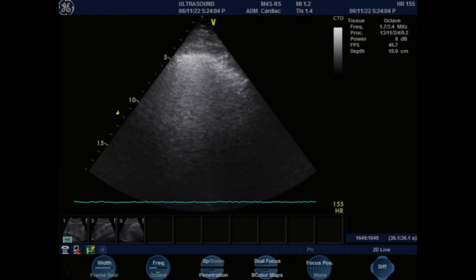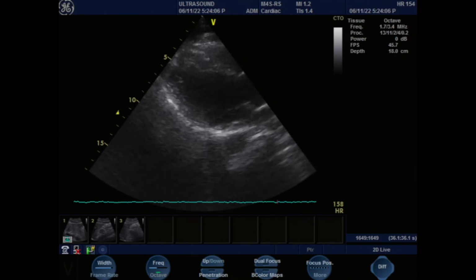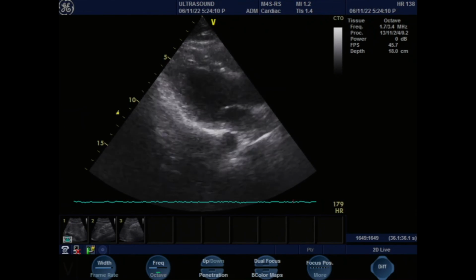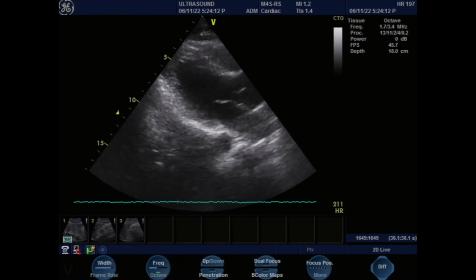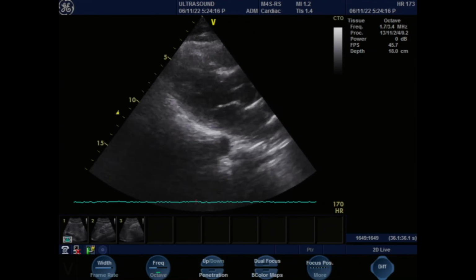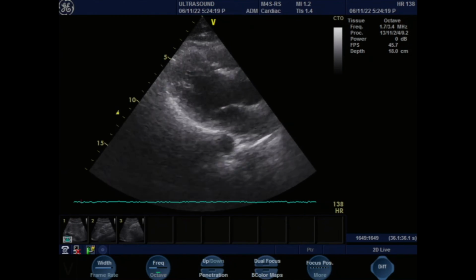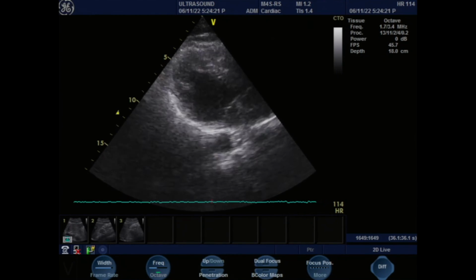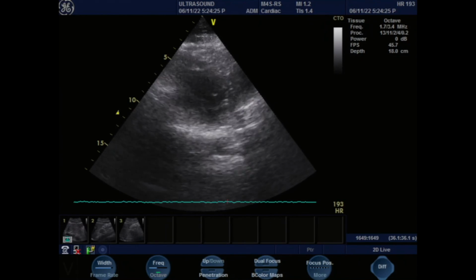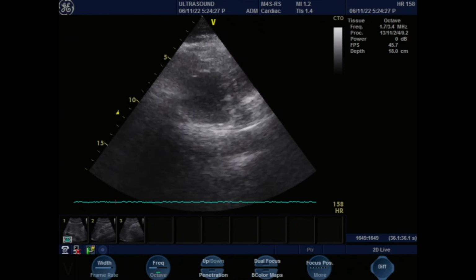Look at the landing. Perfect. There you are. Now you see the entire left ventricle right here. This is the septal wall that we're seeing. The right ventricle is cut off a little bit. The aortic valve, mitral valve, the atrium. You get what you get. Go for it. Now you see the donut. That's a descending aorta? Yeah, it's a descending aorta.